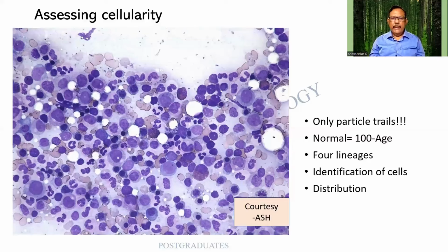Identification of the cells matters most. And as I had been telling you people, differential count is the only tool to learn the cells. I am not going to go into it, but then there is a plethora of it. Your slides under your microscope will be able to give a much better refractive index than this. So I am able to see the neutrophilic series, and then probably, as I told you, maybe these are the lymphoid or the erythroid cells. Identify a cell by the company it keeps. But what I should appreciate is a highly cellular marrow.